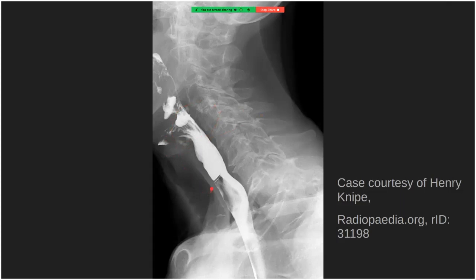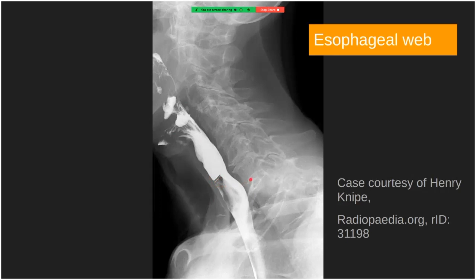This upper esophageal double contrast study shows a small thin filling defect along the anterior aspect of the cervical esophagus — consistent with an esophageal web. Esophageal webs can be seen secondary to autoimmune mucocutaneous blistering diseases; blisters that form in the esophageal mucosa, once healed, can scar and develop this web appearance. Other causes include mucosal inflammatory diseases such as Stevens-Johnson syndrome.